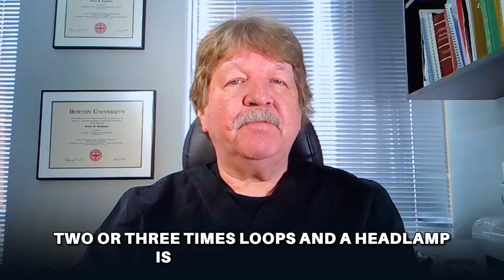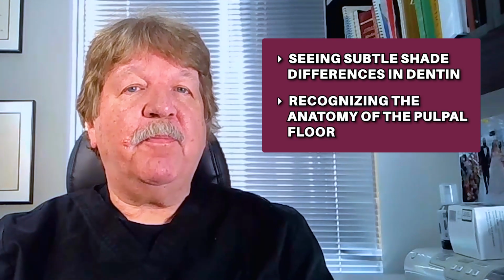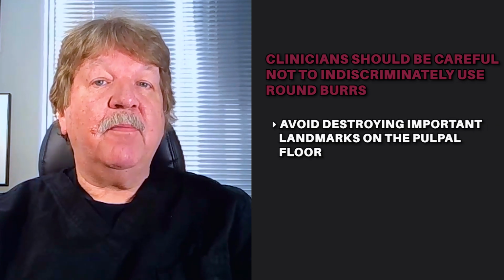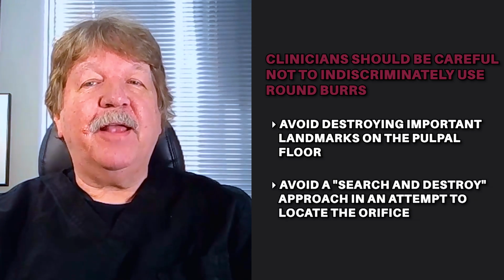It's very important to have a good magnification source and a very good light source to be able to see adequately. 2 or 3 times loupes and a headlamp is often not enough, I'm sorry to say. Locating MB2 is dependent upon seeing subtle shade differences in dentin and recognizing anatomy of the pulpal floor. Clinicians should be careful not to indiscriminately take round burrs and destroy important landmarks on the pulpal floor in a search and destroy mission in an attempt to locate the orifice.